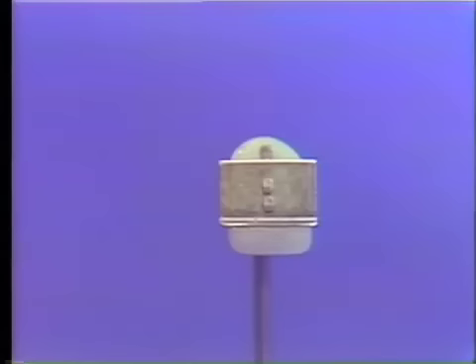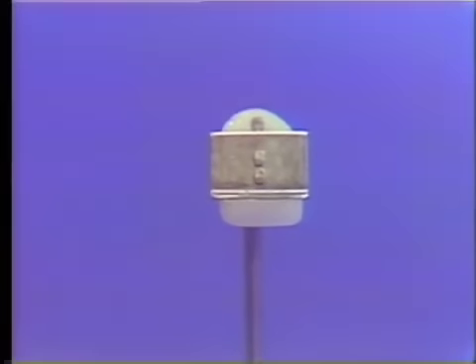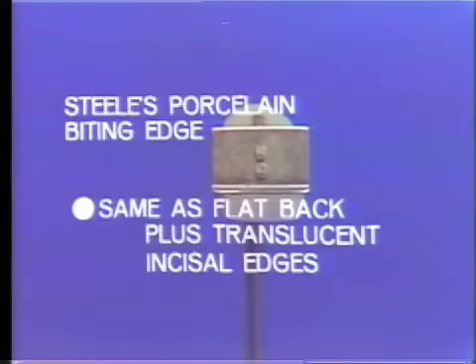In all other aspects of its design and characterizations of the technique and so on, it's similar to the Steele's flatback. So just to summarize it, we can say that it's got all the same characteristics of the Steele's flatback, plus the ability to get translucent incisal edges. Not often used, but one that one should be familiar with.